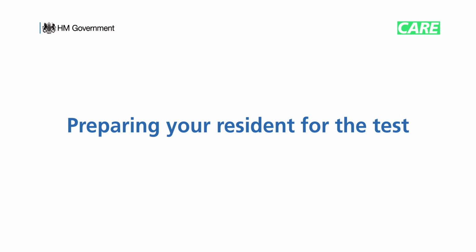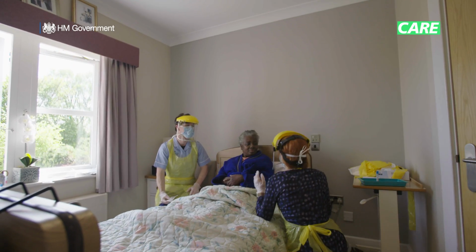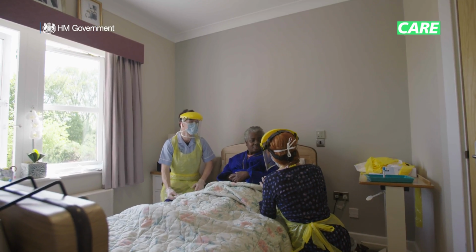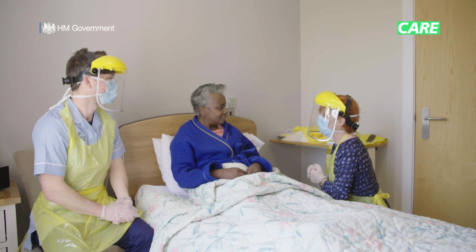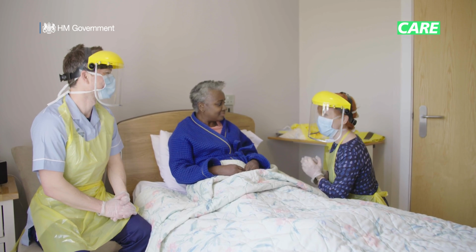So let's get started. The person you're testing might be nervous, scared, or unsure. Take a moment to talk to them gently. Walk them through the steps and ask them if they have any questions. Staying calm and confident in yourself will be reassuring for them and will make them feel more comfortable. Whilst you perform the test, your colleague can sit with them and comfort them through the process.